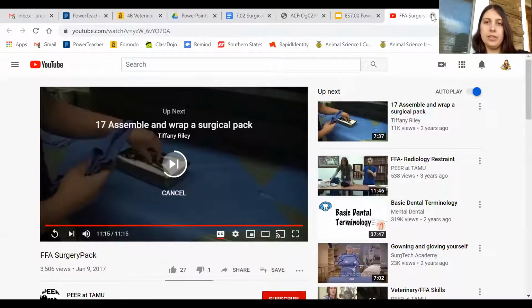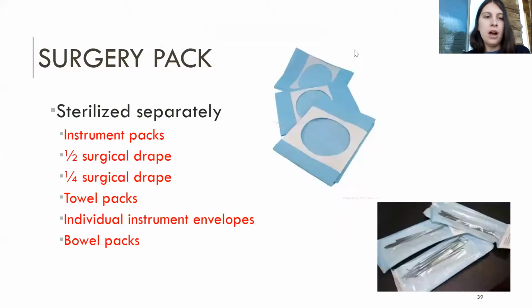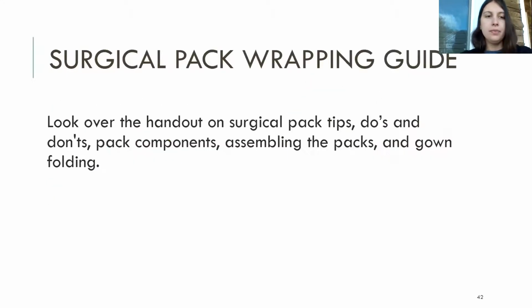All right. So, kind of a longer video, but very, very helpful. You've got the instrument packs that are in there, the half drape and the quarter. The half drape is the larger, and then the quarter is that last little small one that we saw. We saw the gauze sponges, the suture material, surgical blade, all that stuff.